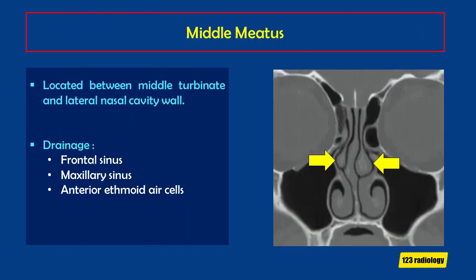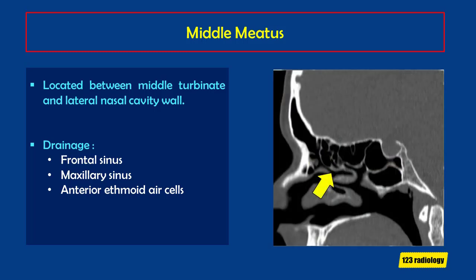The middle meatus is found between the middle turbinate and lateral nasal cavity wall, as you can easily see on coronal images. It receives drainage from the maxillary sinus, the frontal sinus, and the anterior ethmoid air cells. On sagittal images, you can find it by localizing the ethmoid bulla, as it sits underneath that.